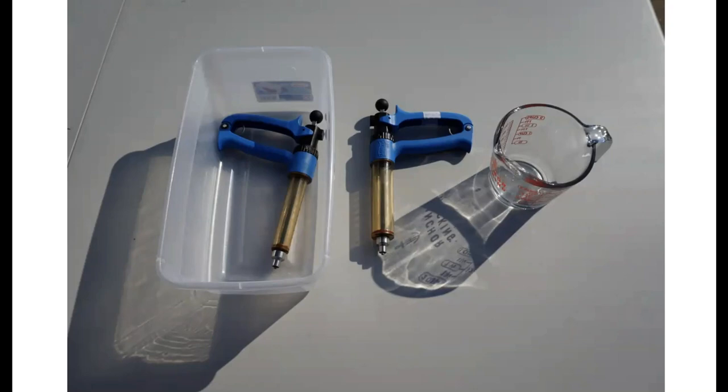Because if you don't, hot glass in a freezer doesn't tend to work out real well. So let it cool off to room temperature, then you can put everything in the freezer till you get ready to work cattle the next time. So that's a technique I use. Some people want to break those apart and put them in boiling water. You can. If you're going to do that, you need to have a dedicated container that you're going to boil in. Don't take a pot or something that gets used for cooking and boil those syringes in there. So that's why I really like this approach of just getting my boiling water in the measuring cup and just flushing that syringe with the boiling water.